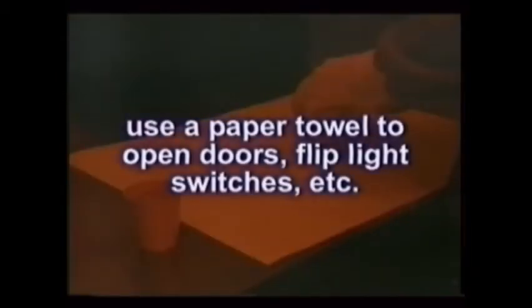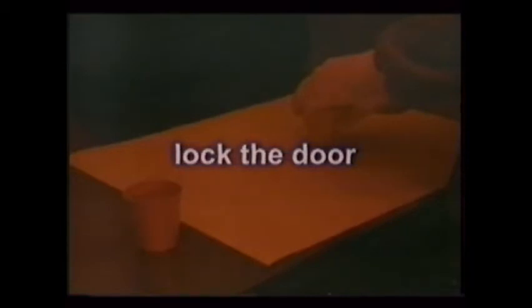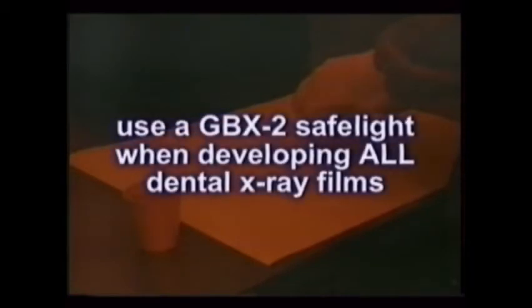If a dark room door must be opened, be sure to use a clean paper towel, not your soiled gloves. Once inside the dark room, lock the door if there is no in-use light on the outside. By law, every dark room must have a safe light for developing intraoral and extraoral films.